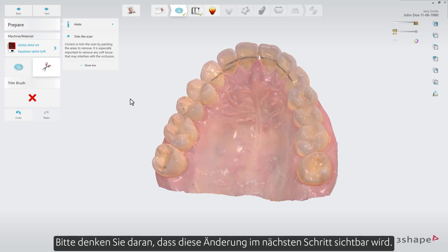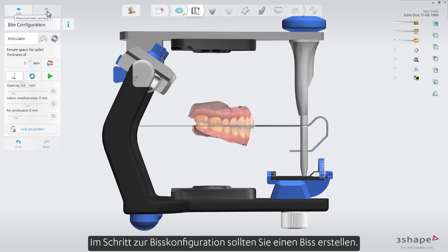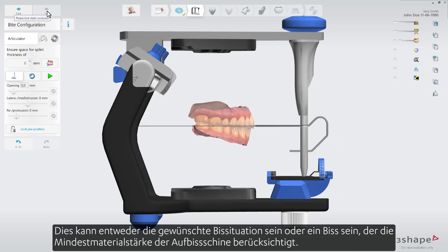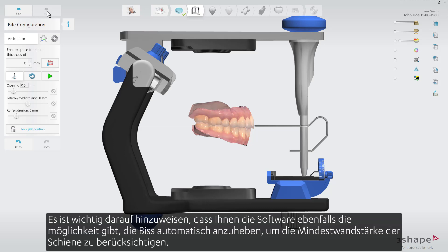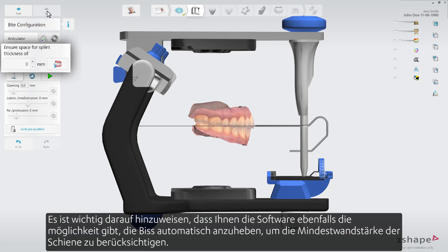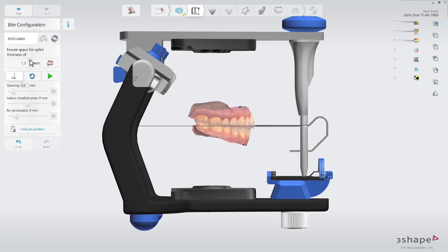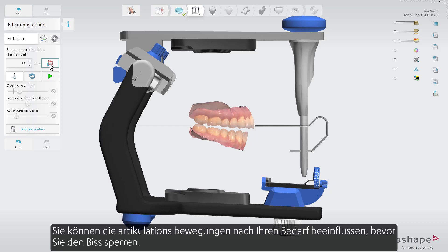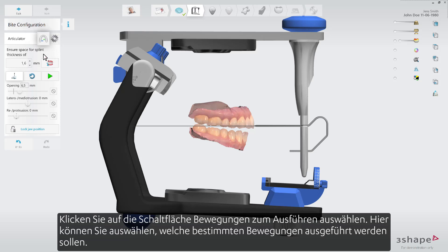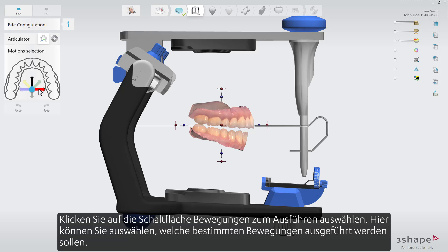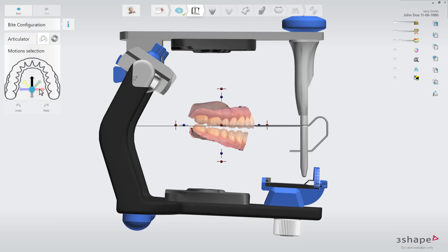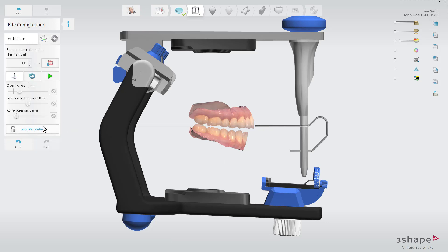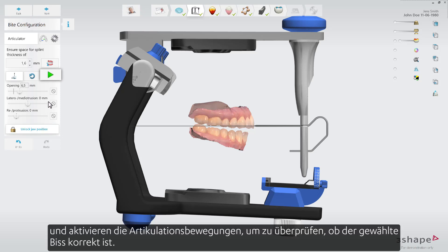Please remember this change will become visible in the next step. In the bite configuration step you can construct a bite — either the target bite or a bite that could accommodate an occlusal splint of a certain thickness. The software enables you to open the bite to the given splint thickness. You can also select the specific articulated and non-articulated motions before you lock the bite. Press the select motions to perform button and choose which specific movements you wish to be performed. Lock jaw position and run articulation to check if the chosen bite is correct.